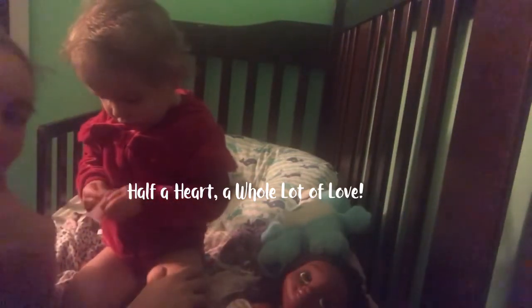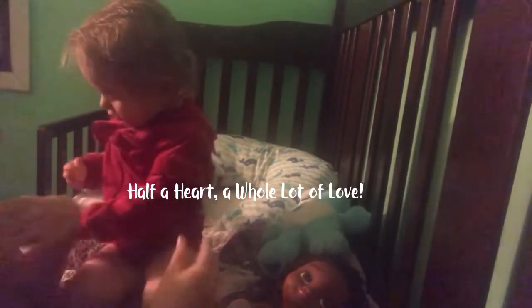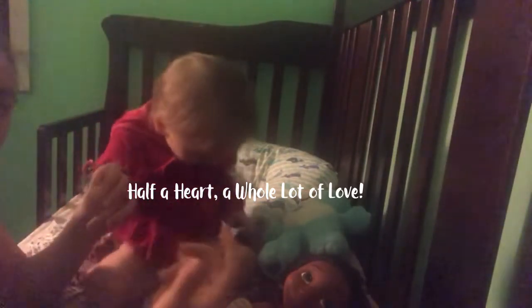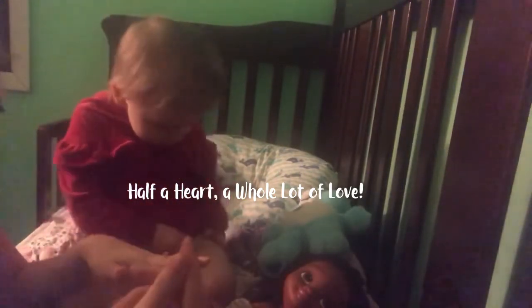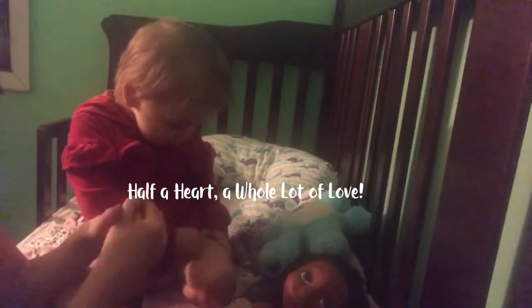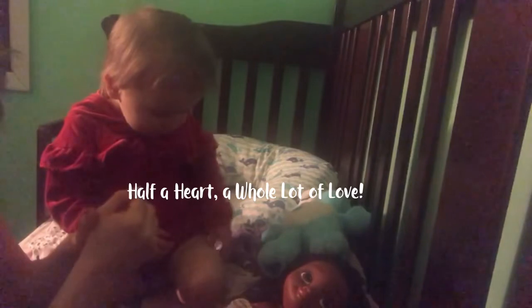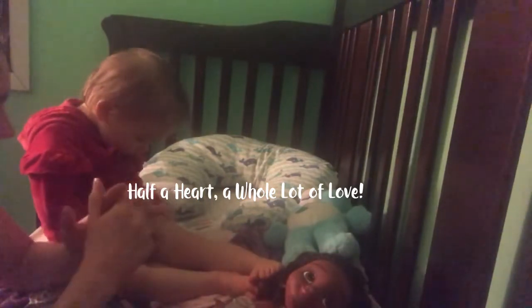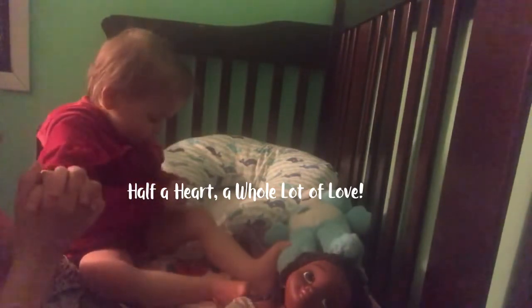Like I said, I'm a little tired tonight. But yeah, 45-degree angle going into the fat. Quickly push it in. You want to make sure that you're done pushing it all the way in before you take the needle out. That's a huge thing too. Sometimes I think we get a little bit frantic at that point, so it's easy to want to just pull out as quick as you can, and then they don't get all of the medicine. Of course it's very important for them to get all of the Lovenox into their little legs, to help with those clots.